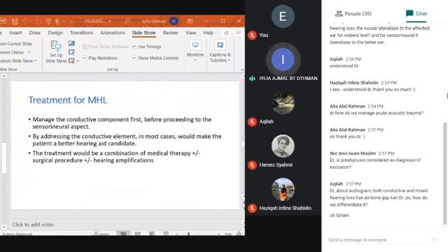You can Google this thing. You look at different types of audiogram. Later when you come to the clinic, you will see different types of audiograms because you need to read this. We will ask you in questions. It might be in your essay, it can be in your viva.